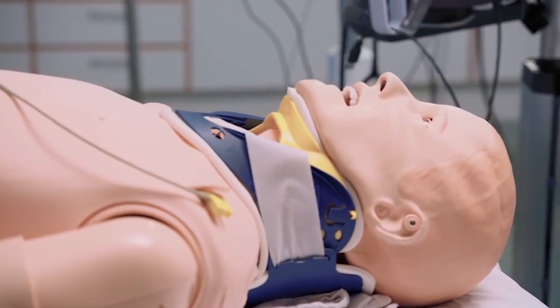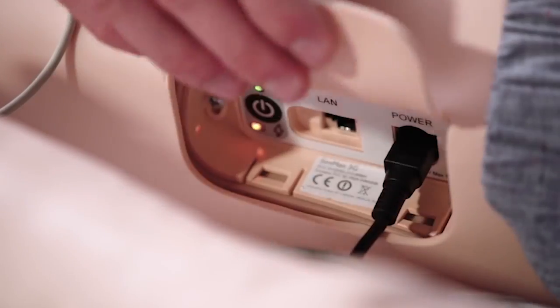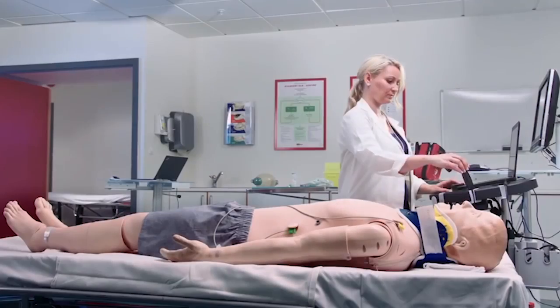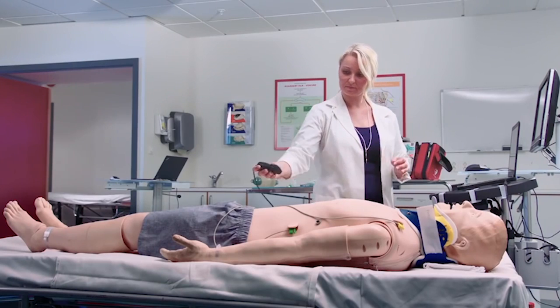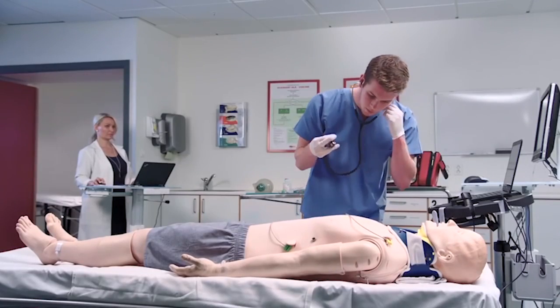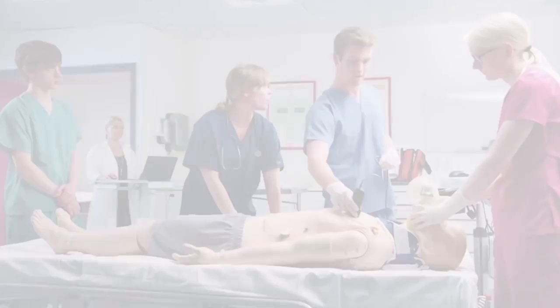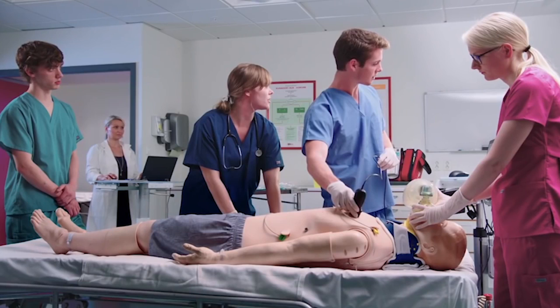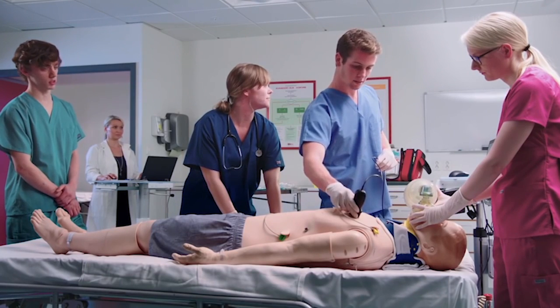Laerdal and Sonosim proudly announce the integration of the Sonosim ultrasound training solution into the Laerdal patient simulator platform. This means you can now include diagnostic ultrasound featuring real ultrasound cases with pathological findings into full-scale simulations. Laerdal is clearly the leader in patient simulation, and they recognized a paradigm shift occurring in medicine — the fact that ultrasound has become a critical part of how we assess patients.